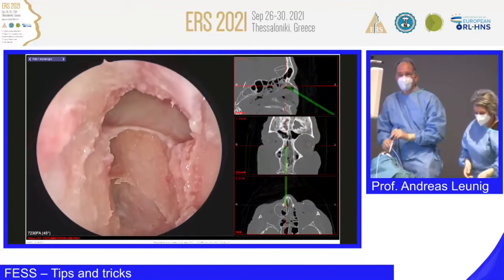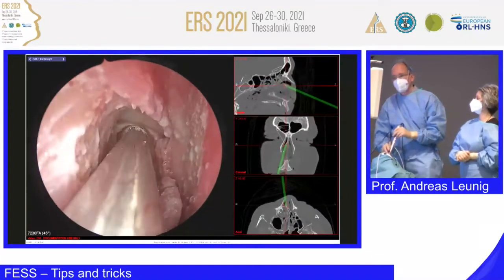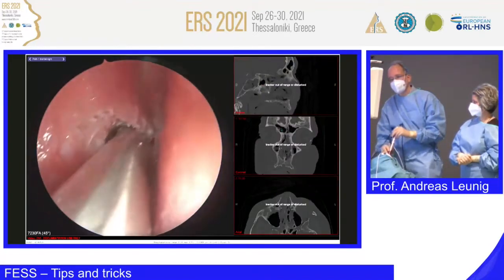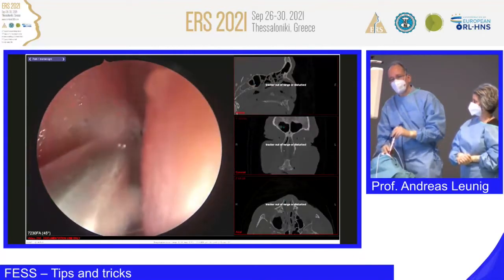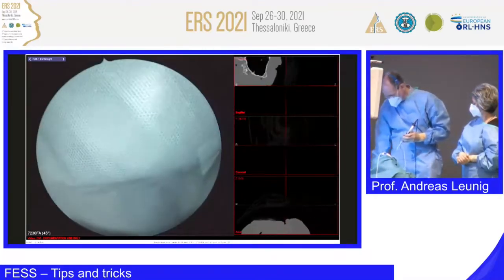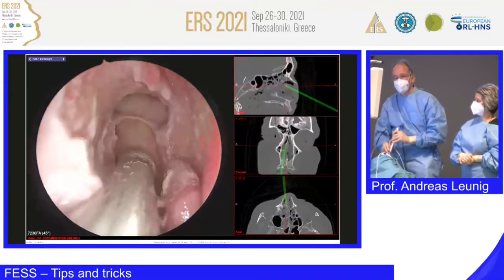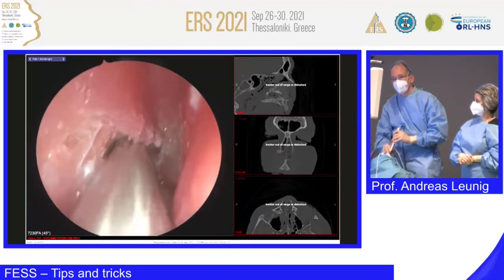So this is a type 2 opening. I can do a little bit more to give you a nice final picture of this opening. Of course, you can do a little bit more here. It depends on the osteoma you have to take out. If it's a big osteoma, you have to make a wide opening. I would prefer this kind of approach to deal with a pathology that can be taken out, but it has to be done in the hands of an experienced surgeon. And as well the equipment; not everybody has all the equipment.